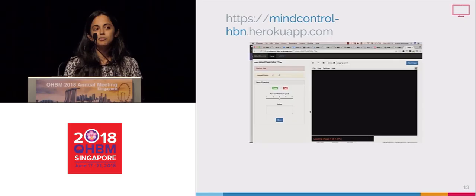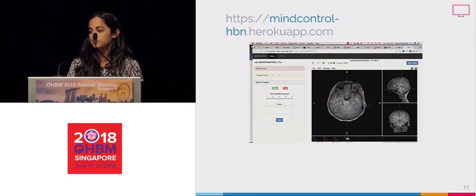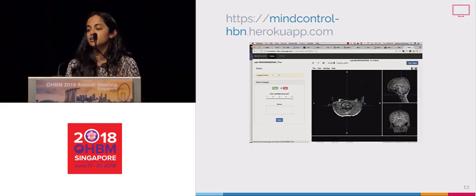So I created this app called Mind Control, which stands for Brain Quality Control. And for those of you on your laptops, you can try the website right now at mindcontrol-hbn.herokuapp.com. As you can see in this video, you can open a nifty image. You can scroll through all the slices, you can change the brightness and contrast, you can pass or fail the image and give us a score of your confidence, and all of this is saved on a global database. There's even a leaderboard for you to compete against your friends.